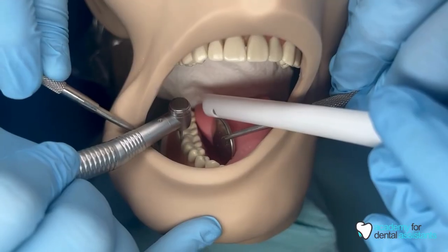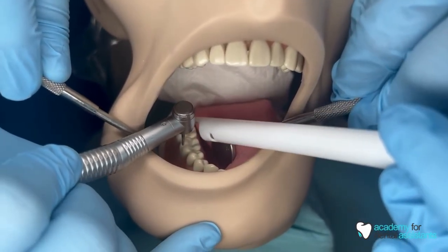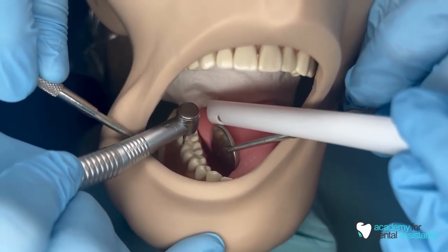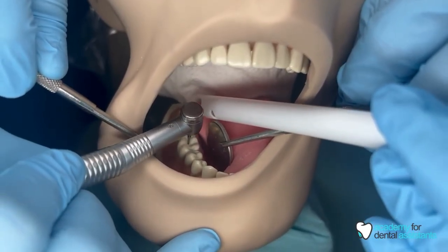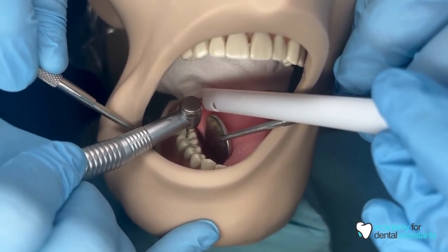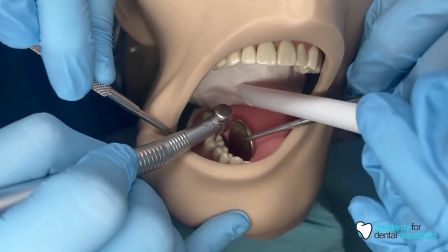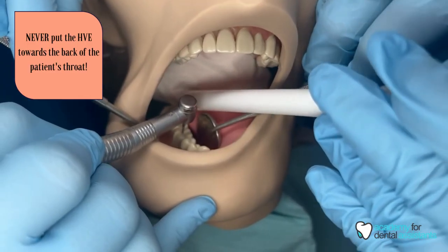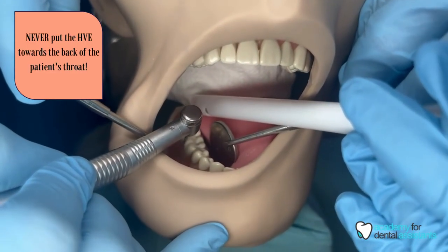Now the doctor is working on the buccal of number 30. We are using our mouth mirror to retract the patient's tongue, as well as keeping the HVE right above on the occlusal and lingual side to make sure that we're not in the doctor's way. When using the HVE, never stick it directly towards the back of the patient's mouth — always keep it right there where the doctor is prepping the tooth.